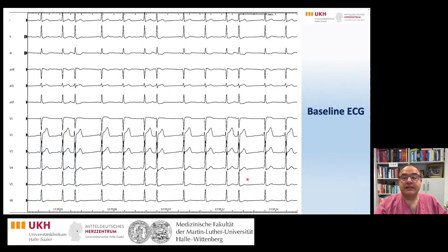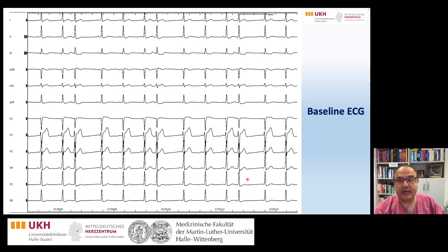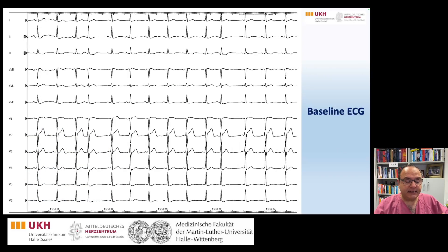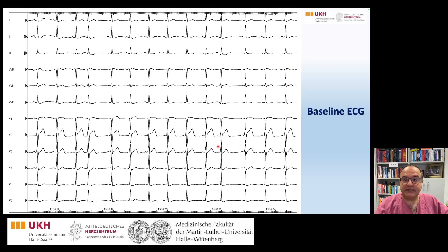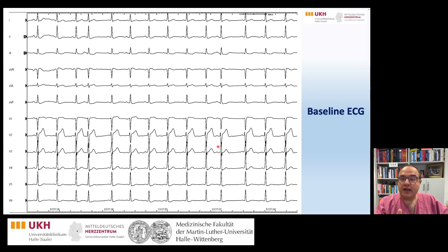The baseline ECG shows frequent premature atrial contractions, and in the next ECG we see one PAC with a longer coupling interval, which enables us to analyze the P-wave morphology and so somehow localize the PAC before catheter ablation.